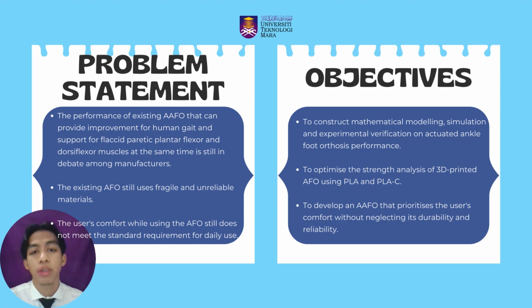The objectives for this research are to construct mathematical modeling, simulation, and experimental verification on actuated ankle foot orthosis performance. Next, to optimize the strength analysis of 3D printed ankle foot orthosis using PLA and PLAC. The last one is to develop an actuated ankle foot orthosis that prioritizes the user's comfort without neglecting its durability and reliability.